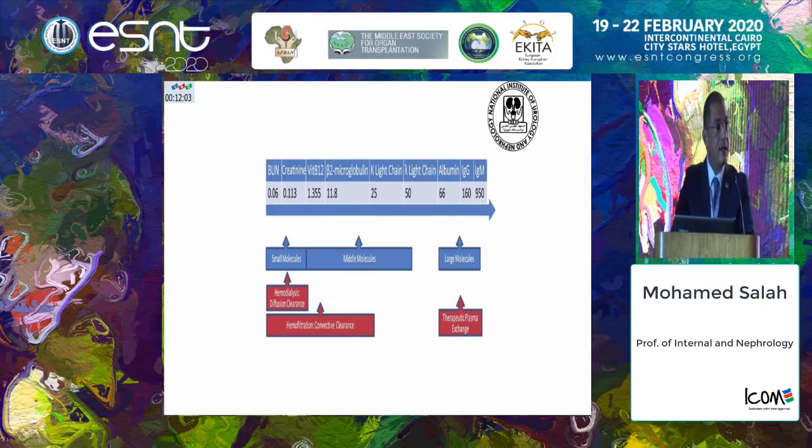Here we can see the effect of different modalities of dialysis, or how we reduce these substances from the blood in relation to the different molecular weights.